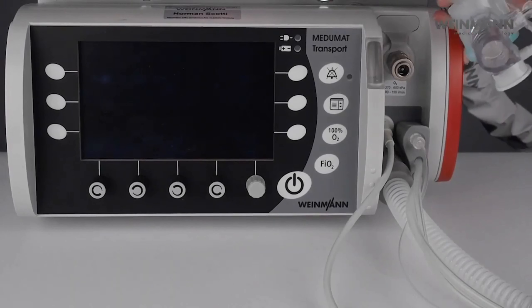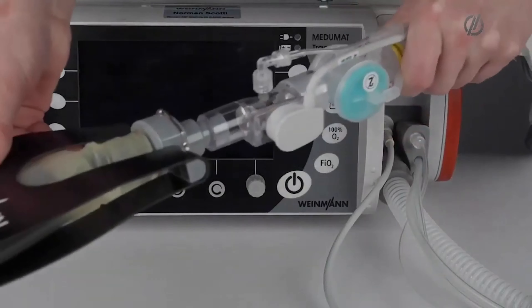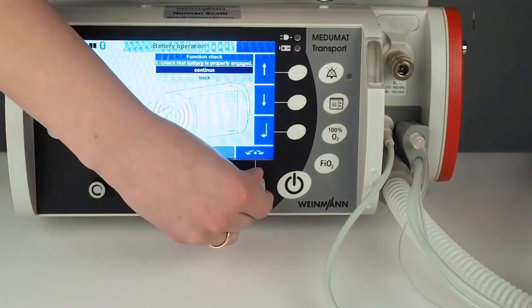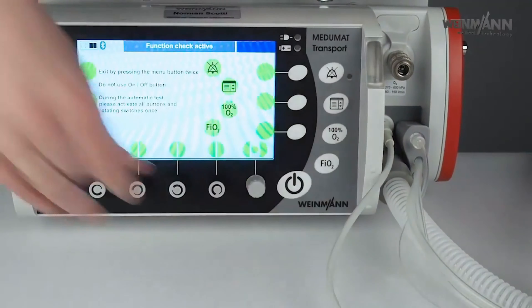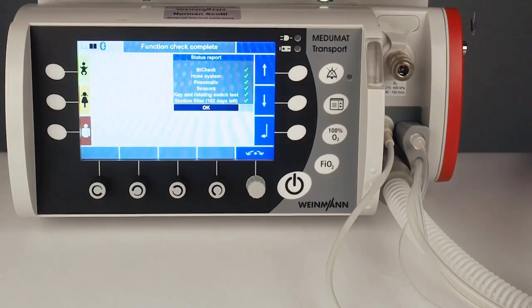Now that we have prepared the device, I would like to show you how to do a function check. First, connect the test lung to the whole system, turn on the device, and then press 'Function Check.' Check that the battery is tight and then start the function check — turn and twist every knob. The device in parallel does the automatic check of the internal sensors and the external flow sensor. After a few seconds, you will see the status of the function check. Everything is green, so the device is ready to use. Please only use the device if you see this result.